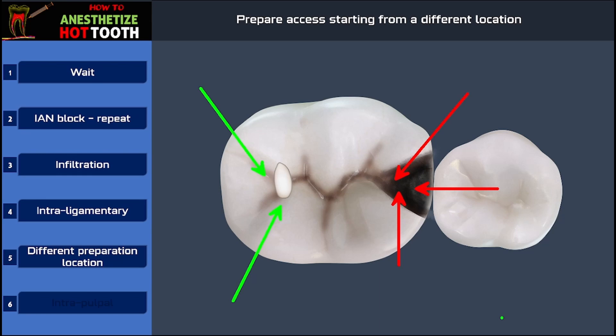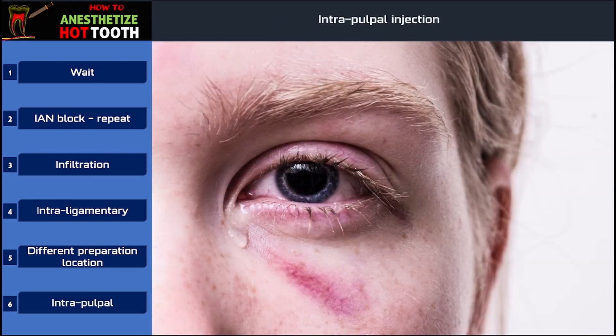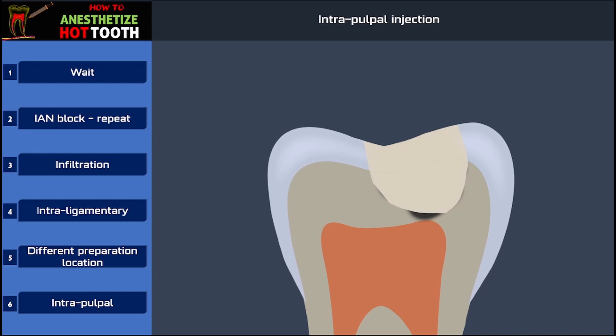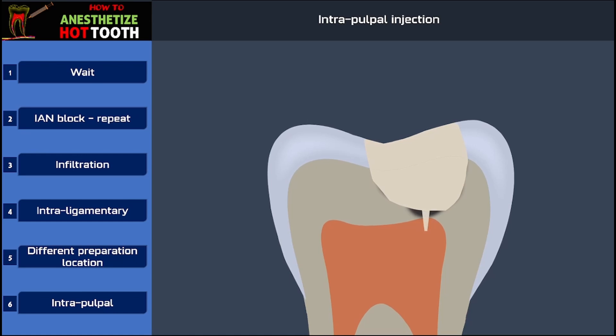Some of you might be wondering how this technique works, but it really does work. When everything else fails and the patient is still not able to tolerate the treatment, the ultimate weapon for every endodontist during root canal treatment is intrapulpal anesthesia. Before giving intrapulpal anesthesia, inform the patient that the procedure is going to be briefly painful. Do not practice this procedure on patients who are under treatment for seizures, cardiac problems, or who have extreme anxiety. Remove the caries as much as possible — complete removal is not needed since it will be difficult when the patient is in pain. Then take a small needle bur and make a small entry inside the pulp chamber.